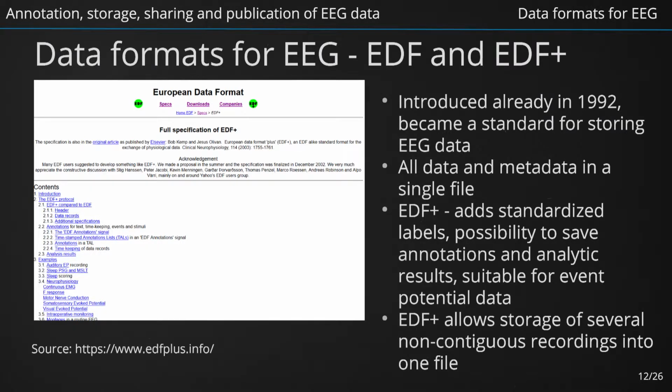An EDF or EDF Plus data file consists of a header record followed by data records. The variable length header record identifies the patient and specifies the technical characteristics of the recorded signals. The structure of EDF information about signals, subject, and whole measurements is defined and cannot be changed. The EDF Plus format includes, for example, a version of the format, patient identification, record identification, number of data records, duration of records, and number of signals in the data records.